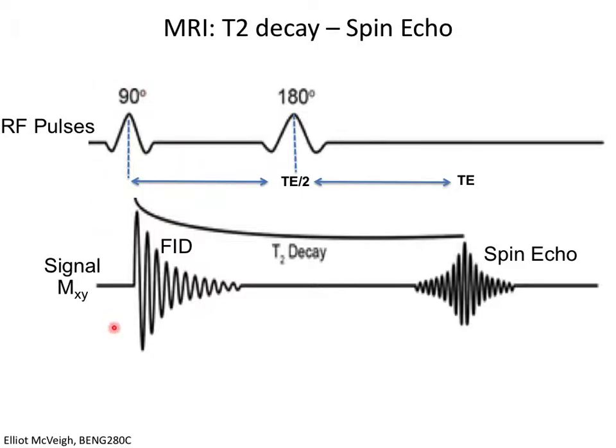We did this very simple pulse sequence. This is NMR imaging. When you get into it, it's all about designing pulse sequences to elicit a signal from the patient that have different intensities based on underlying parameters such as flow and relaxation times. And so these pulse sequences are created, and essentially what they are is an amplitude versus time of things like RF and gradient pulses. And this is the signal that is measured on the same time axis.